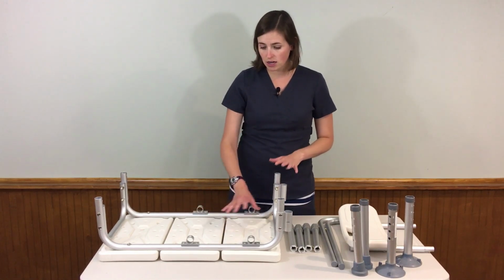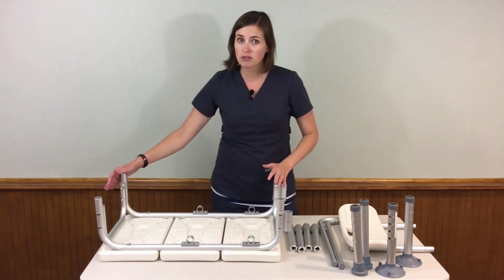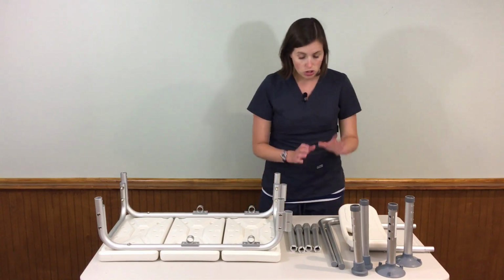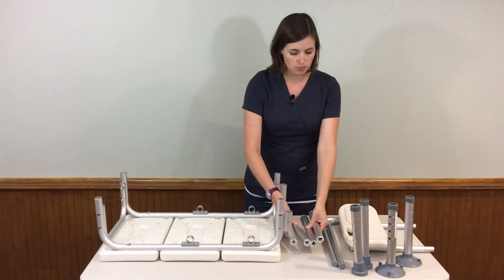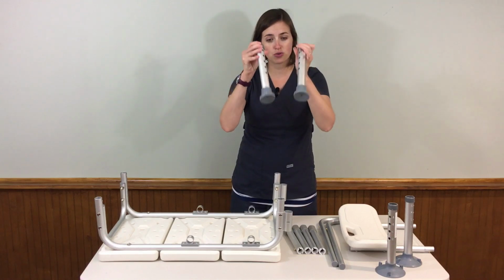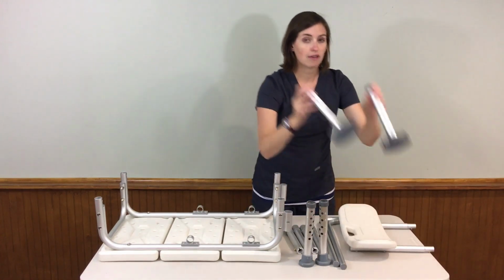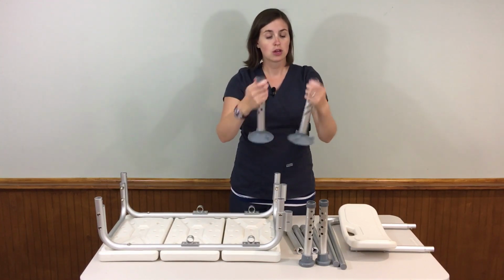So I've got the base here. All of this should come attached, so you shouldn't need any tools to attach these pieces. Obviously, if you're getting it used, make sure everything is solid, nothing has corroded or rusted or gotten damaged over time, so this is a good time to check that out. You should have 4 leg extension pieces that look like this that are going to go on the 4 posts, as well as 4 leg pieces. Now they're going to be different. You've got 2 that have these standard bottoms that are slightly slanted. These go outside the tub, as well as 2 that have suction cup bottoms meant to go inside the tub to help the bench be secured in place. So you should have 2 of each.